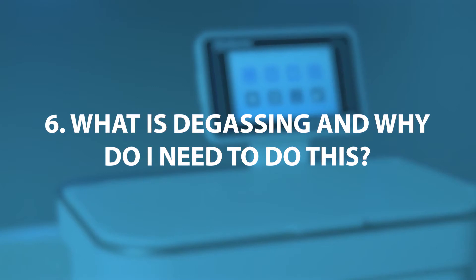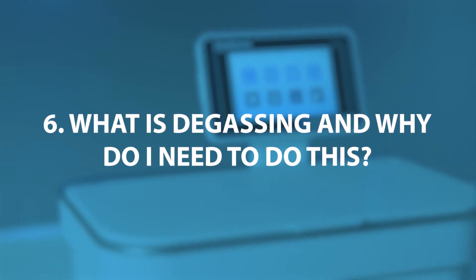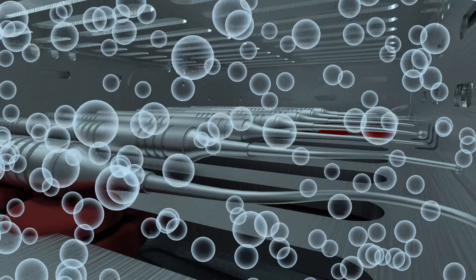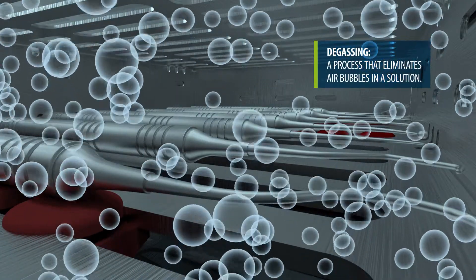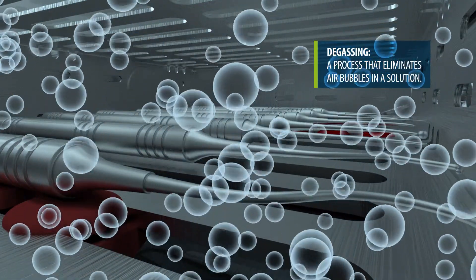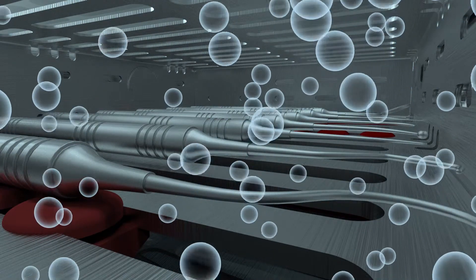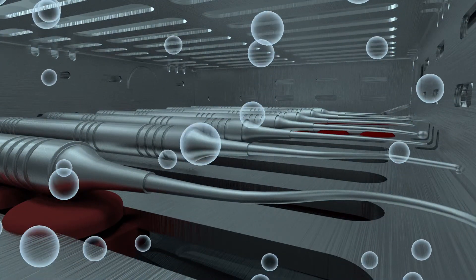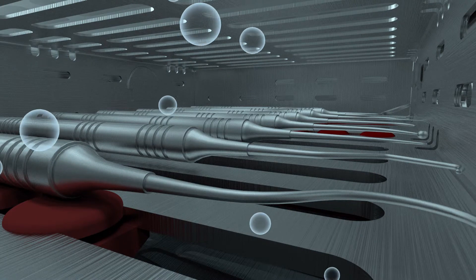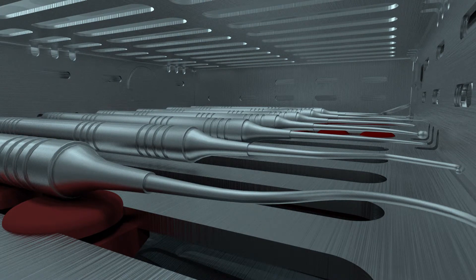What is degassing and why do I need to do this? Degassing is the process of eliminating large air bubbles in a solution. Before cavitation can become effective in an ultrasonic cleaner, the gas trapped in the liquid must be removed. If it's not removed, the cavitation bubbles will fill with this gas, cushioning the implosion force.